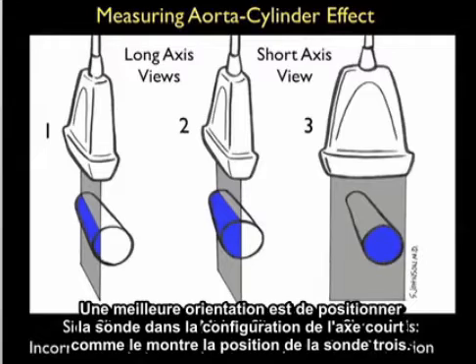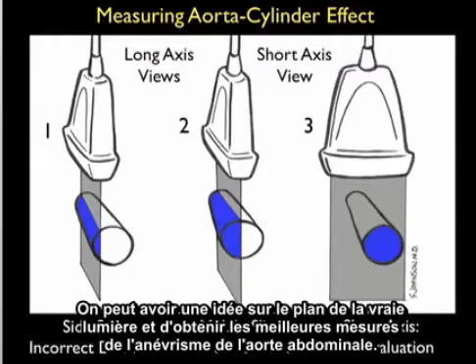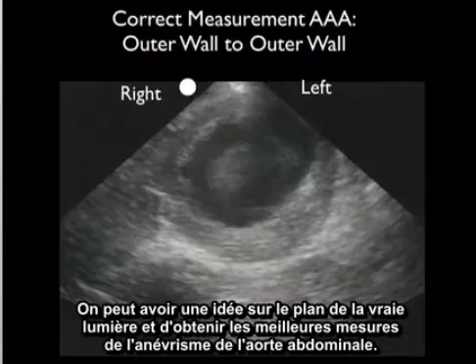A better orientation is to position the probe in the short axis configuration, as shown in probe position 3. One can then get a sense of the true lumen and get the best measurements of the abdominal aortic aneurysm.